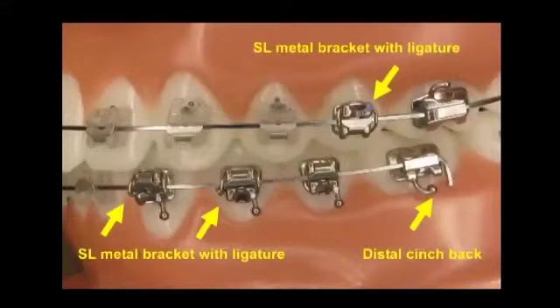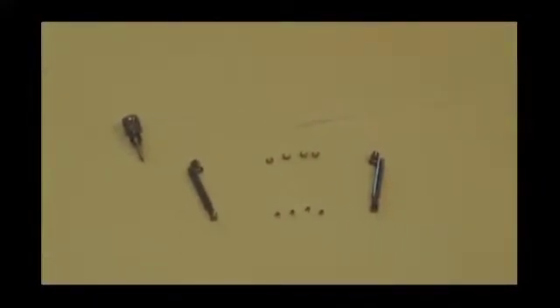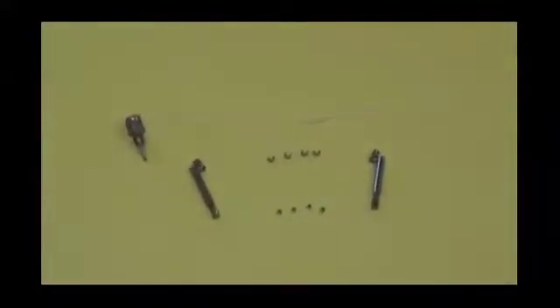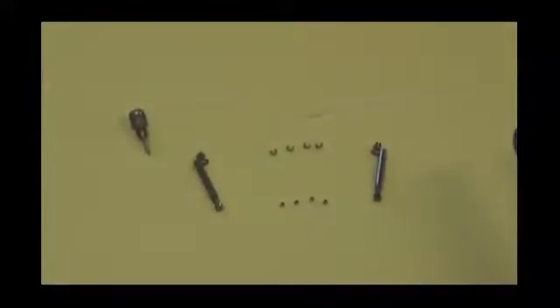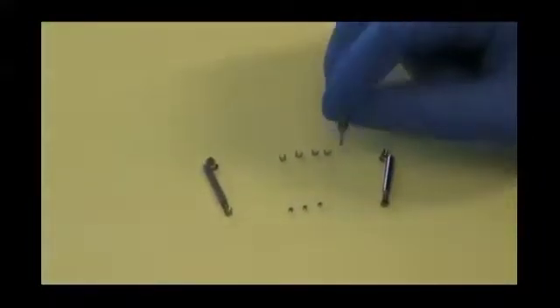Here you will see the ideal conditions for successfully using the Biobite corrector. We will now demonstrate the clinical use of the Biobite corrector. The Biobite corrector is distinguished with left and right sides. These are fixing screws for the connecting element. The spacers are required for the adjustment of the Biobite corrector. The screwdriver should be secured with dental floss to avoid aspiration or swallowing. Use the screwdriver to pick up a screw and make sure that the screw is secure. Additional aids like wax are not required.